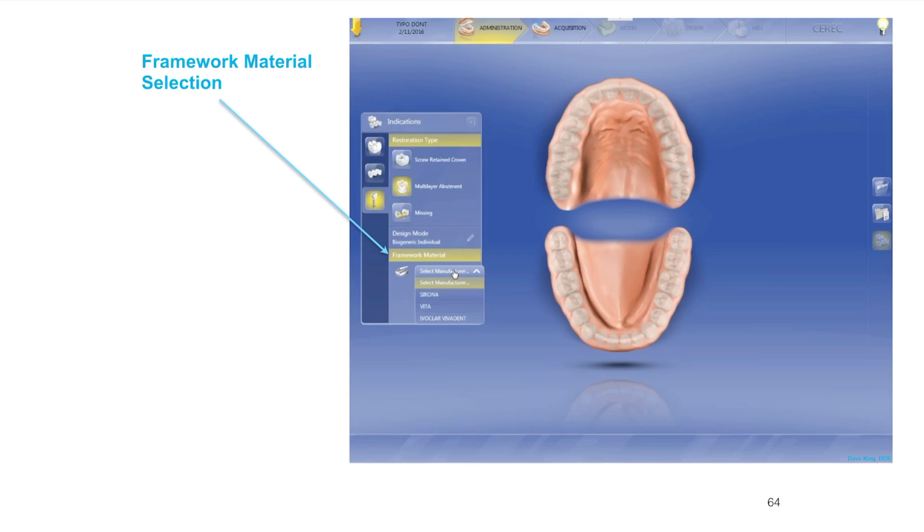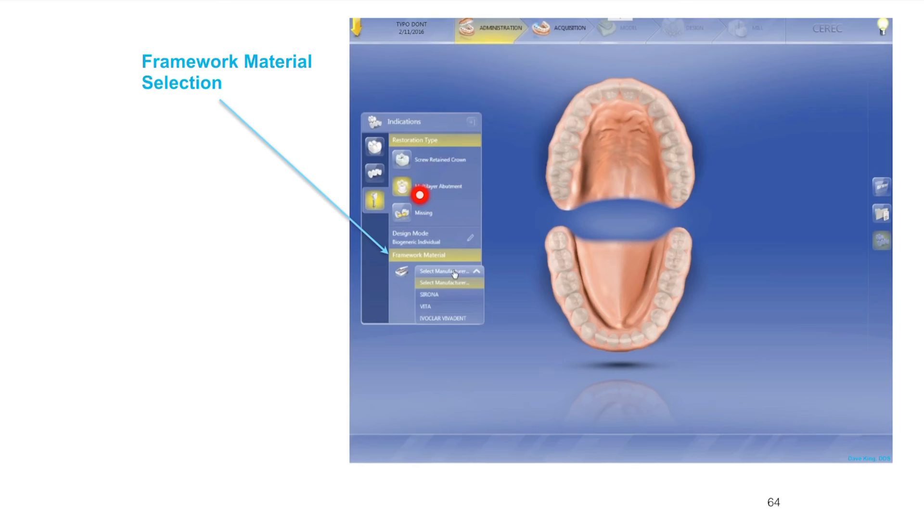The next choice we need to make after selecting the design mode, which I've selected biogeneric individual. If you have a biocopy scan of that tooth before it came out or of a wax up, you can change this to biogeneric copy. We're going to select the framework. Remember we selected multi-layer abutment, so there's multi and there's layer, two layers.